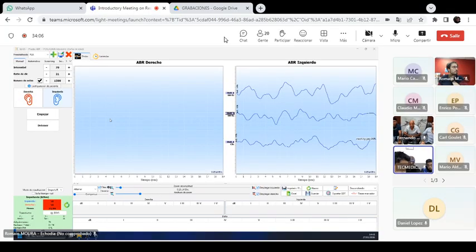The osseous conduction must be from 0 to 55 decibels, and then number 13, the range of frequency for the osseous stimulation, must be from 500 to 4,000 hertz. According to them, they have to check that it's possible to show this in the equipment, in the device, right? That was the problem that we had.